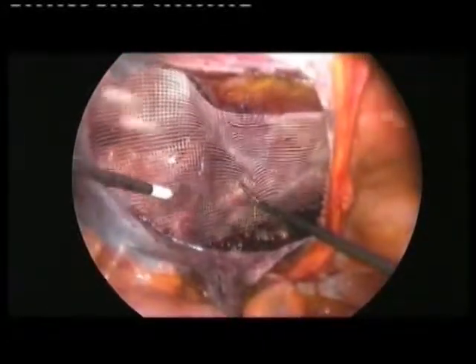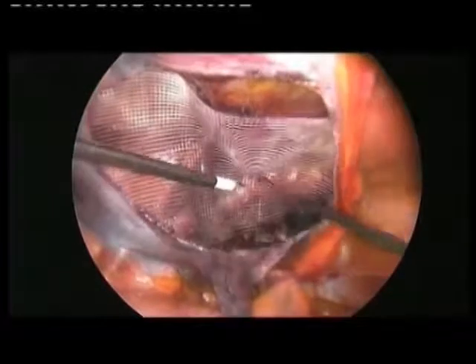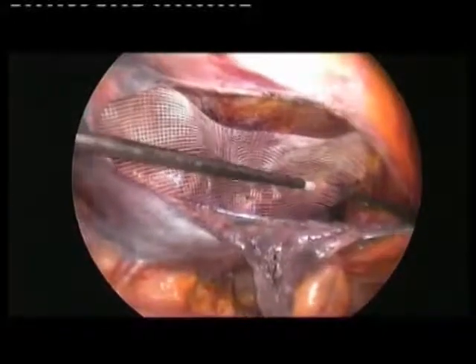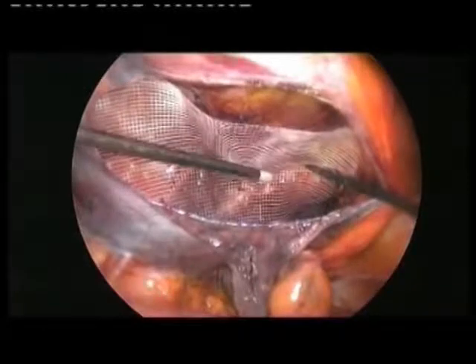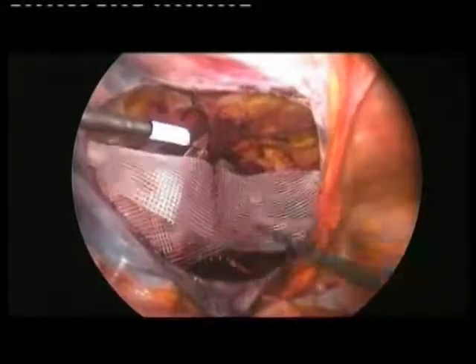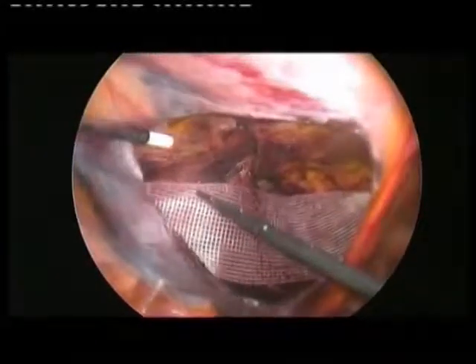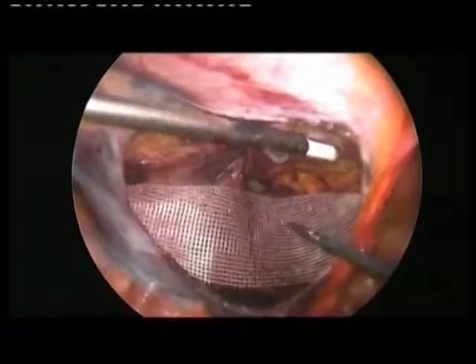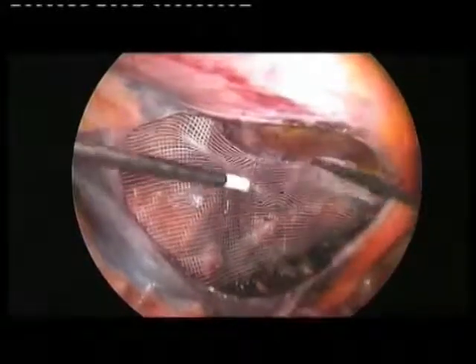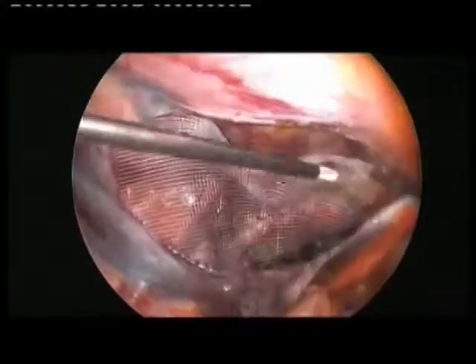You see, I can fix the mesh in this part where it was. It is impossible to put a clip because here we have femoral vessels, so we cannot put the clip. So here we are at the Cooper ligament, the pubis, and now I have fixed the lower part. Then I'm going to fix the upper part. Okay, come closer. Okay. Okay.